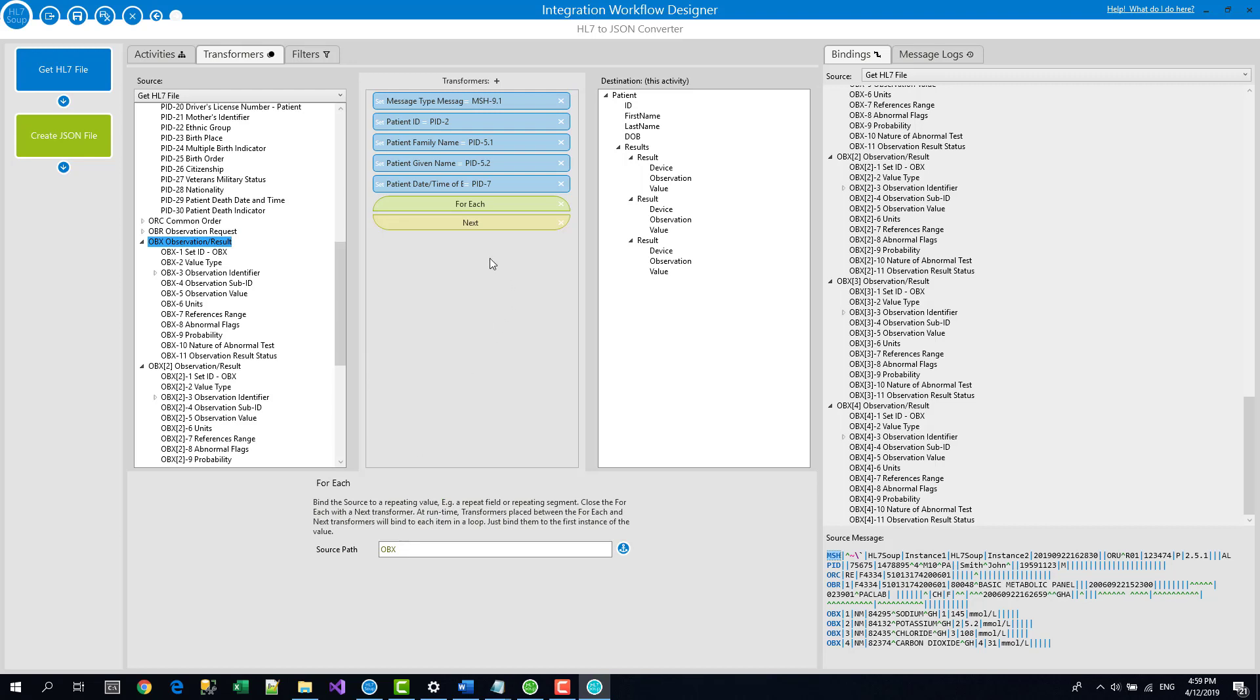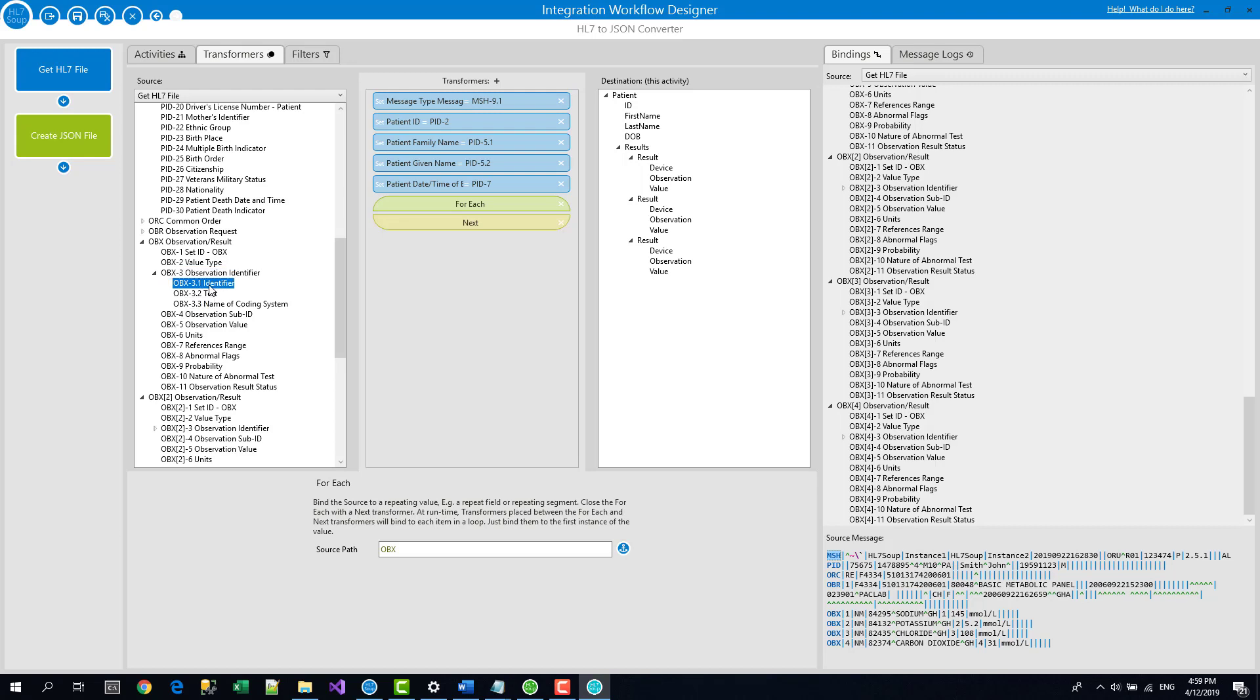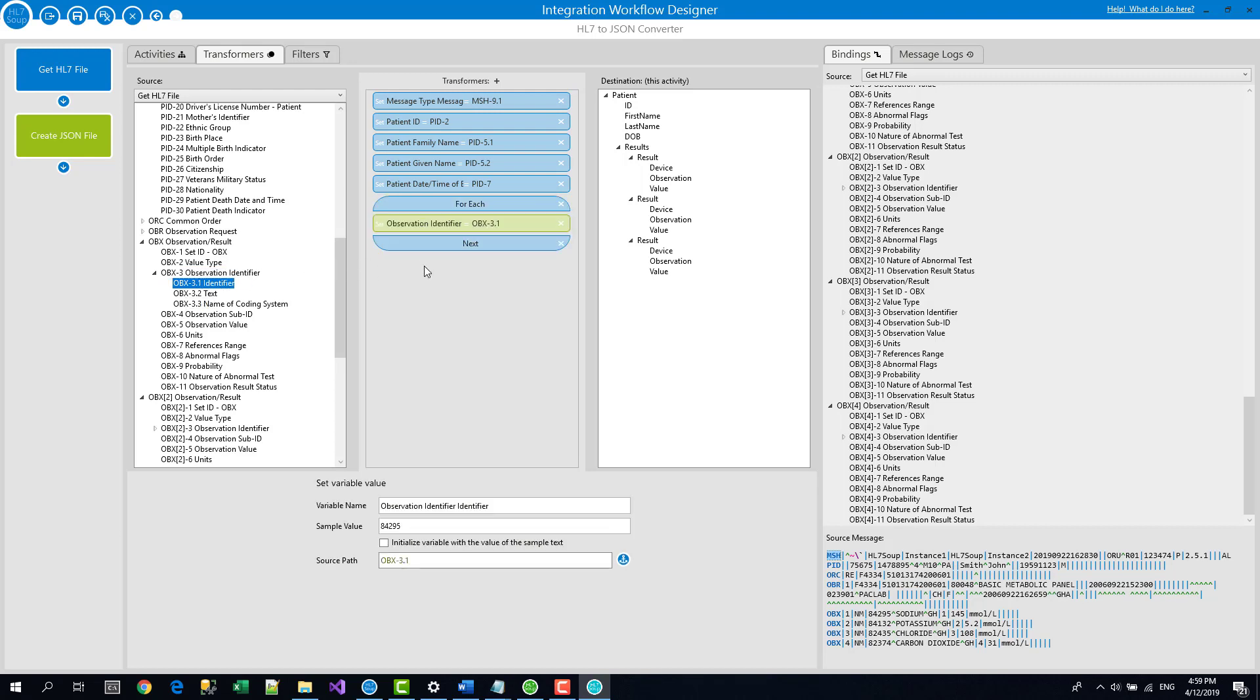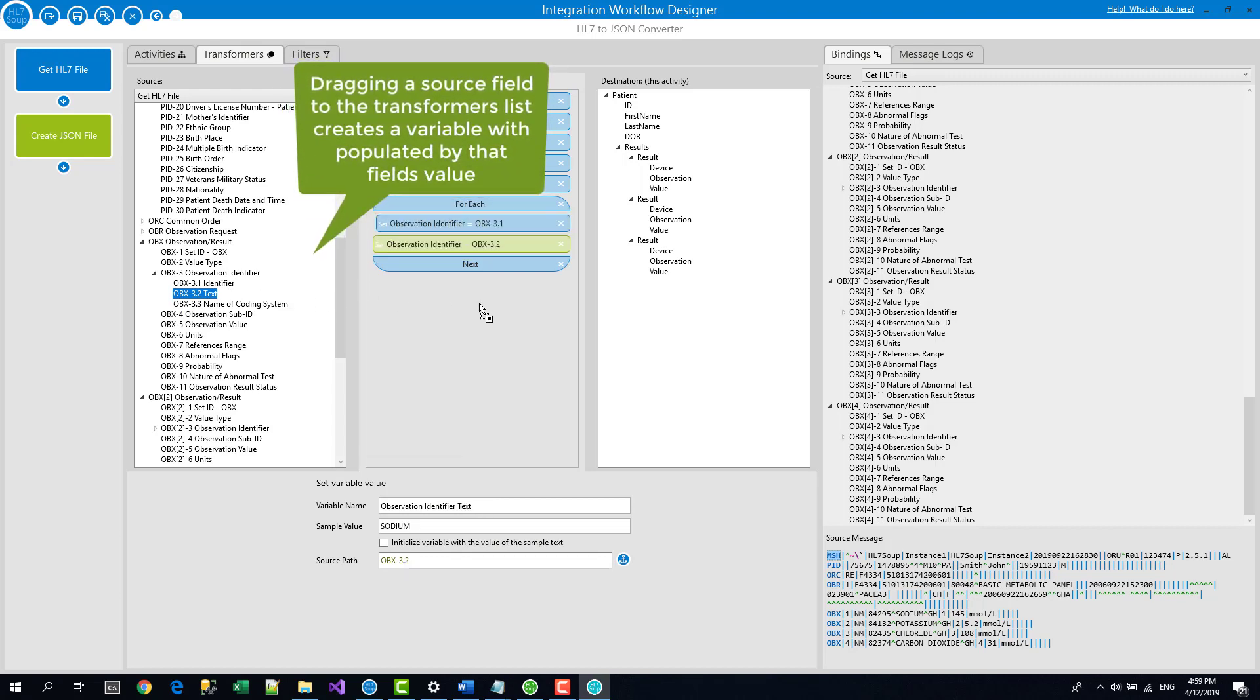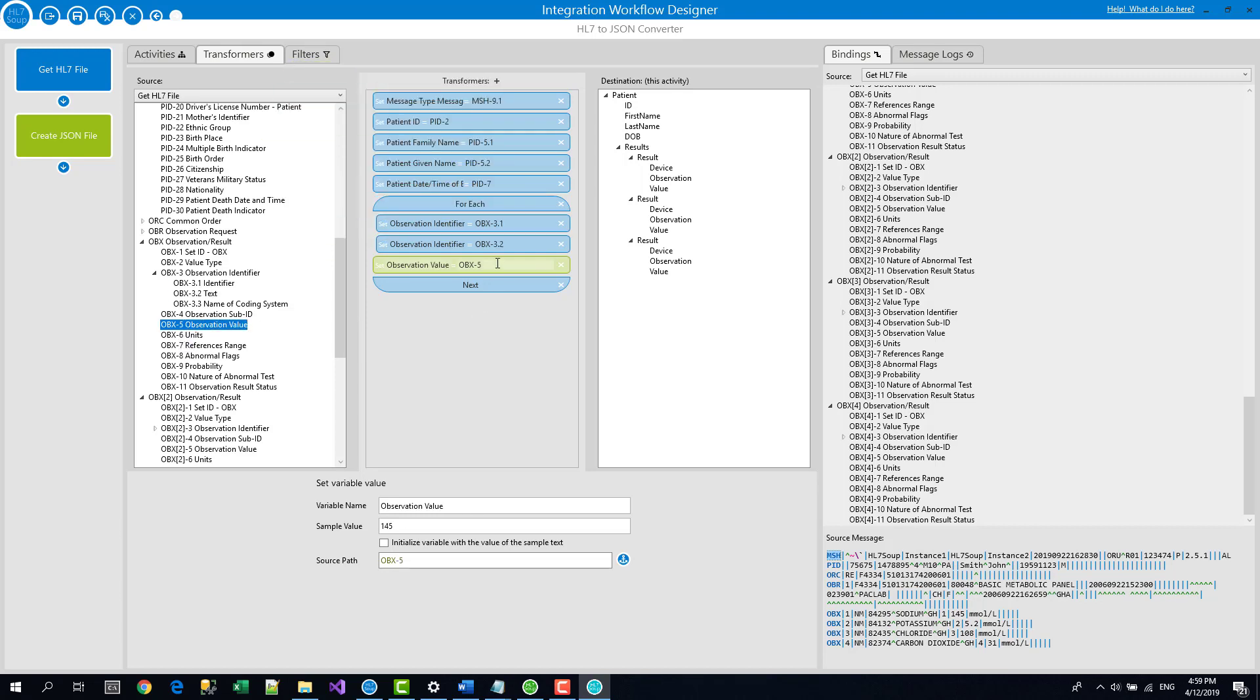Okay, so now we're going to loop over that. We now need to get out the values. Okay, so we have a device and observation and a value. In my message, I'm going to be taking out as the device one of these observation identifier values. So I just want that. I'll just drag that in. I'm going to take out the text. I'm going to use that as the observation and I want the value as well, which is OBX5. So I'll bring that in.